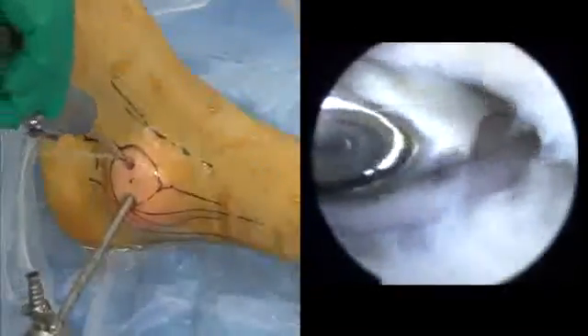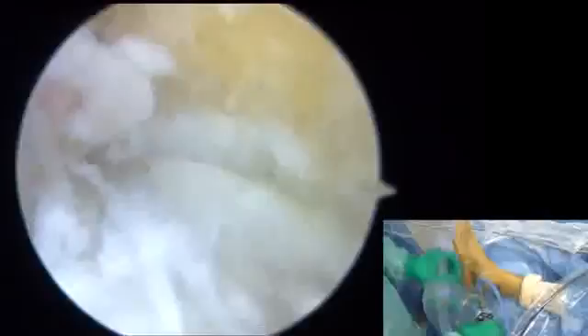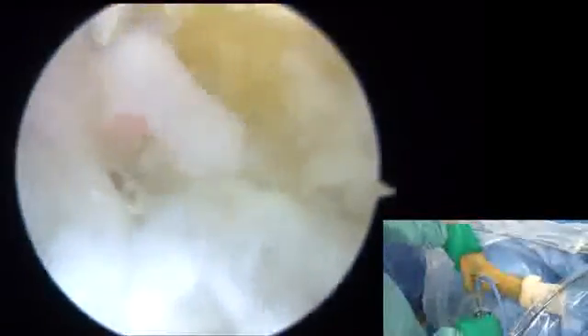The procedure starts with the resection of the white scar tissue. This resection is pushed posteriorly until the anterior aspect of the posterior subtalar joint may be seen. Gentle movements of the hindfoot may help in locating this more precisely.